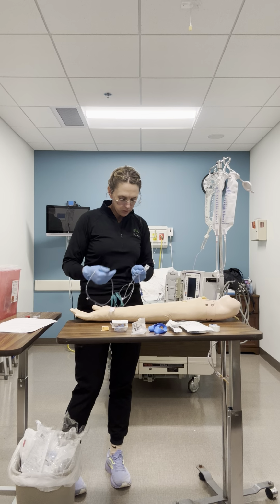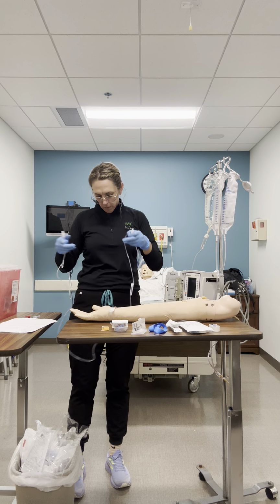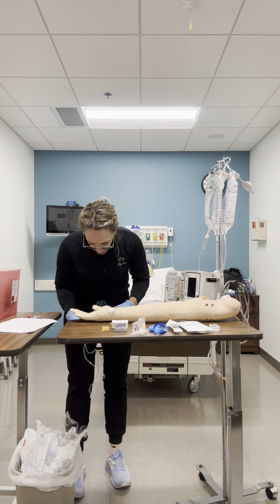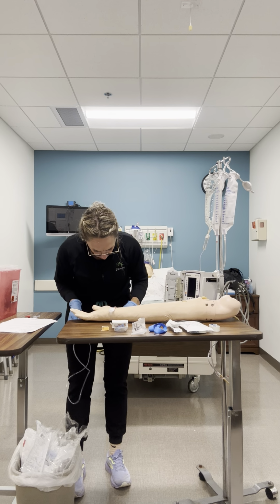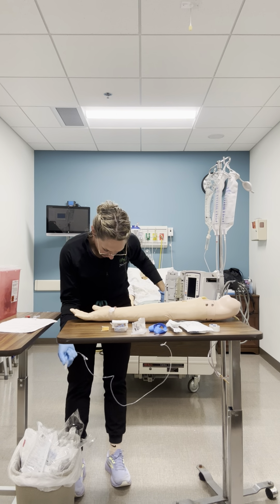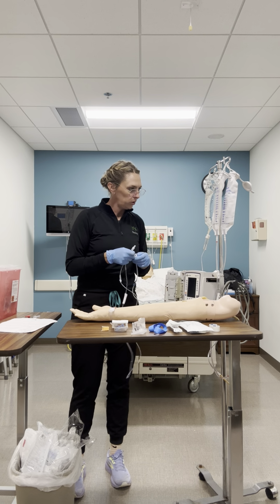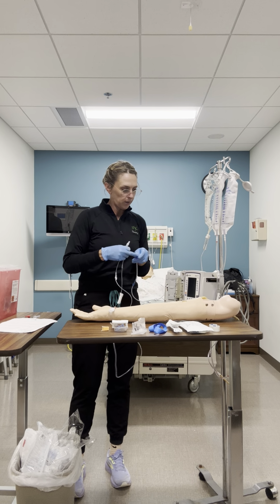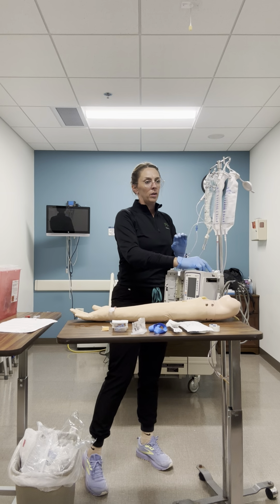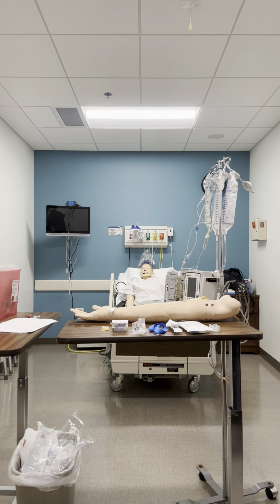So to prime the tubing, I'm gonna make sure that my clamps are both open, my roller clamp and my cassette. And I'm going to open my cassette. And because this has been used, I'm going to close my cassette. And I'm going to have to pull some air out of this line.